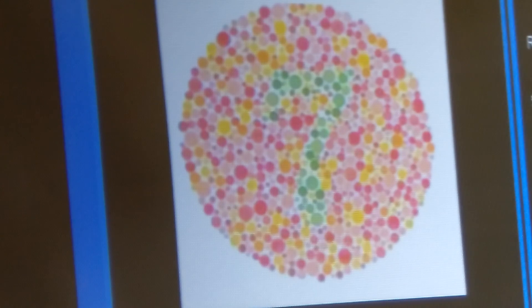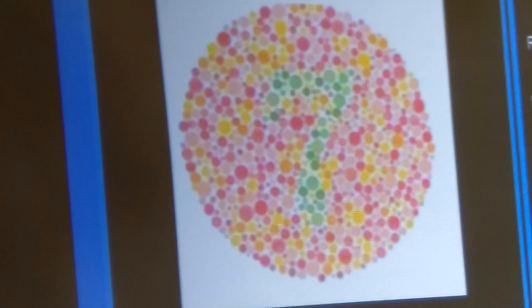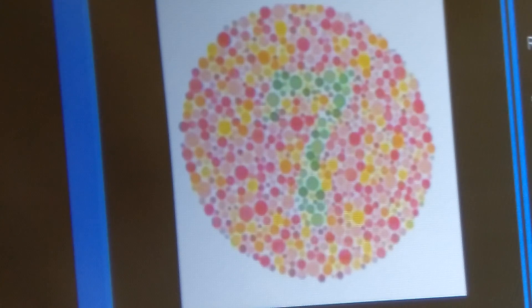Let us know about the latest chart for color blindness checking. What they are doing now, they are using the Ishihara plates but they are showing it on a projector. So today we will see how we see the letters on the projector.